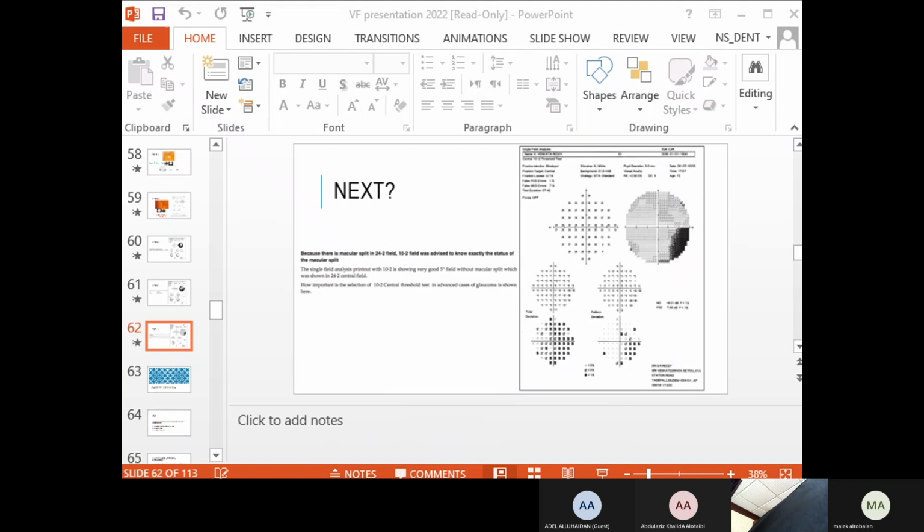Okay, so he was progressing. But if we blame it on the test and we give him 6 months later or 1 year, he will come like this. If this test was the same or better, I would keep him and see him later on. But if it's worse, we need to dig and see if it's really worse or not. We should not keep the patient.